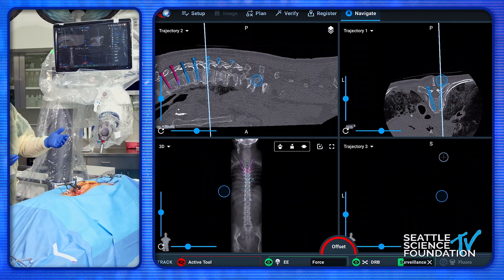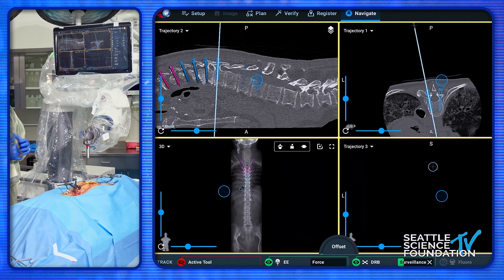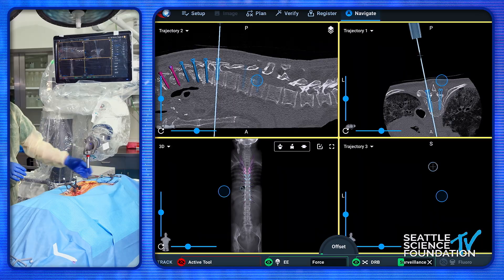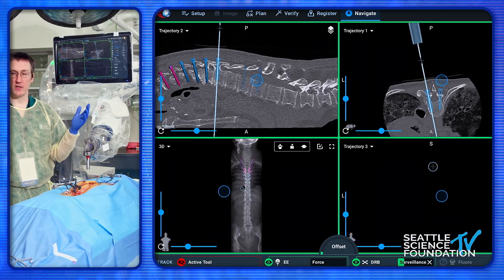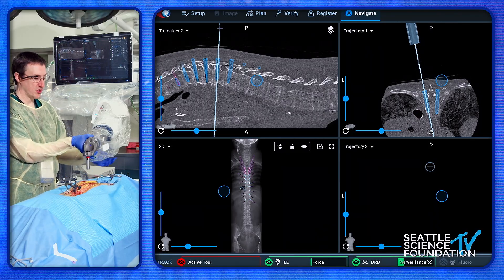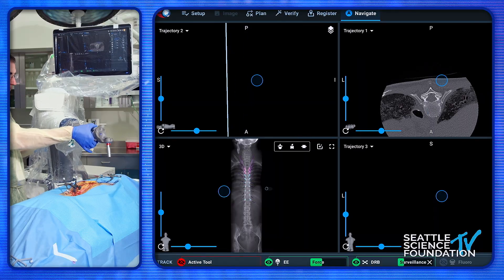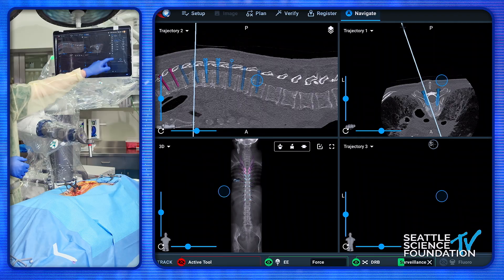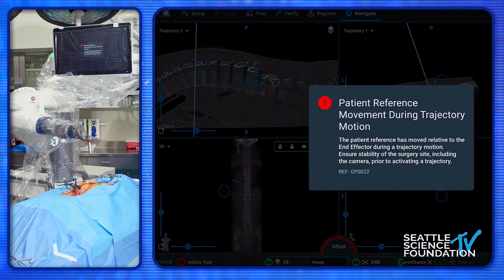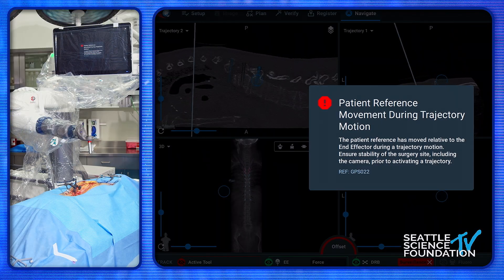Let's say for whatever reason I can't reach this trajectory because I'm going to impinge on some structure that can't be compromised — maybe it's the head or some other obstruction. So here we are: we unclick the screw, grab the collar and push it, then move the end effector into the inverted position. We re-click the screw and send it. As long as the camera can see the end effector we'll be okay — we might need to move that camera slightly to the side.